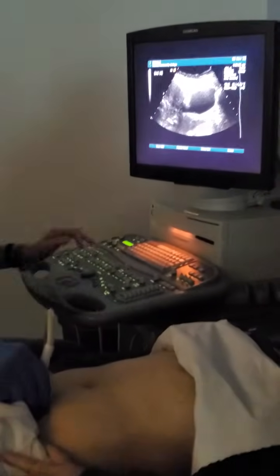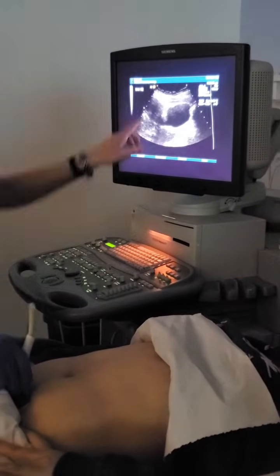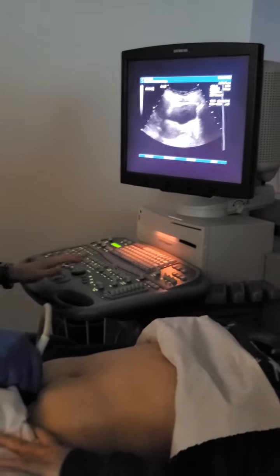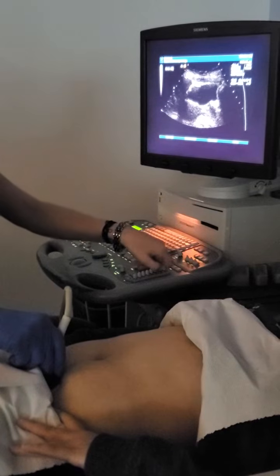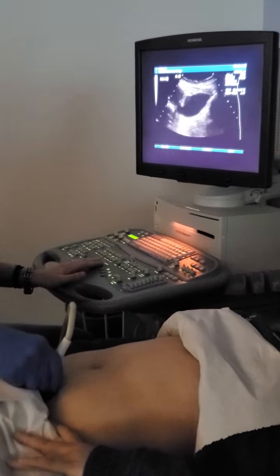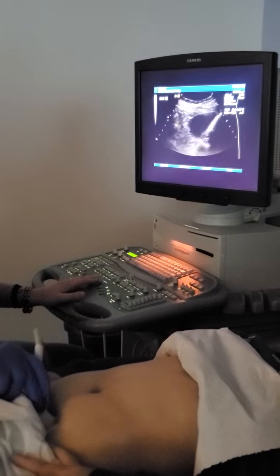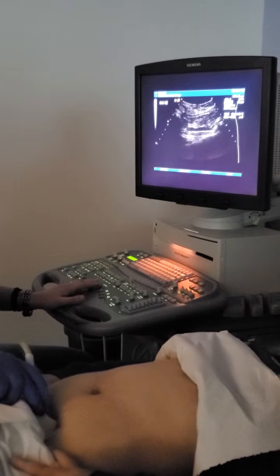Sag, UV. All right, so our first image, we're gonna go ahead and clean this up a little bit. This is uterus. You guys won't need to worry about this. Vaginal canal, cervix, up to uterus. We're seeing a little bit of endometrium. But we're really gonna just focus on this urinary bladder. See that there. All right, so we're gonna sweep through for pathology from one side to the other, making sure there's no hairy scaries going on. Looking pretty good. And there's an iliac out here.